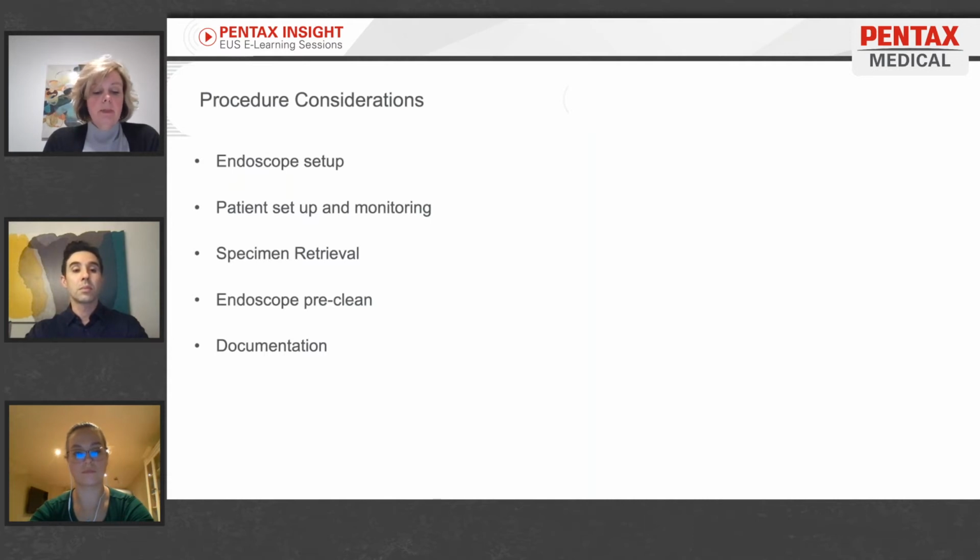But if it's anticipated that a procedure may be lengthy because a therapeutic or tissue acquisition is going to be performed, consider using end-tidal CO2 if it's available at your site. Some procedural sedation policies also require that the patient's sedation level be monitored using the Ramsay scale throughout the procedure. It just ensures that the patient stays in their intended level of sedation and doesn't become over-sedated.